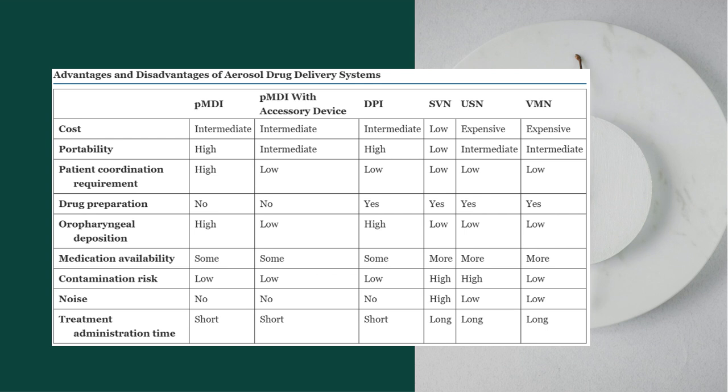Aerosol drug therapy involves delivering medication directly to the lungs in the form of tiny particles suspended in the air. This targeted approach allows for rapid and effective treatment, often with fewer systemic side effects compared to other methods. Nebulizer technologies have evolved significantly over time, offering a range of options tailored to different patient needs and medication types.